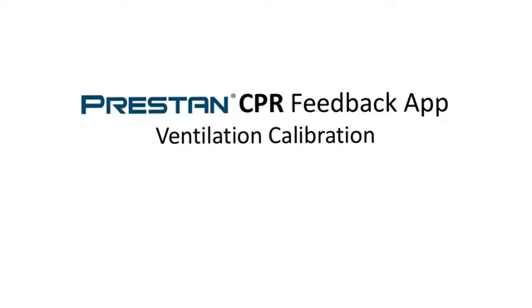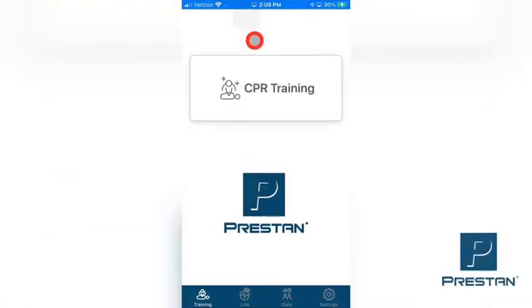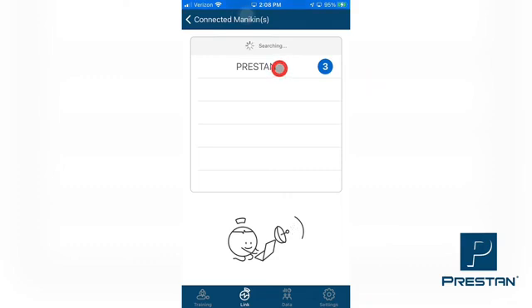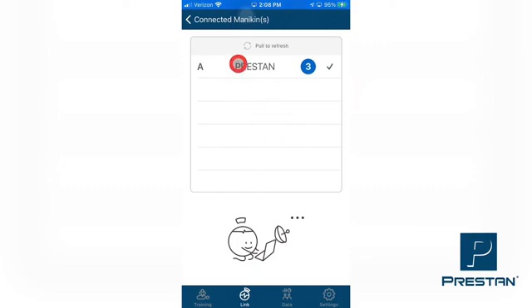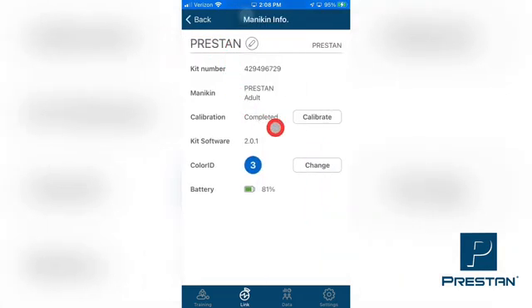Ventilation Calibration: With your Preston Professional Series 2000 Mannequin powered on, open the Preston CPR Feedback App on your smart device and select the Link tab found at the bottom of the screen. Select Search Mannequin. A list of connected mannequins will appear. Select the desired mannequin from the list, ensuring that a checkmark appears next to the name of the selected mannequin. Select Connected Mannequins, and then select the chosen mannequin from the list. Tap Calibrate in the row titled Calibration.